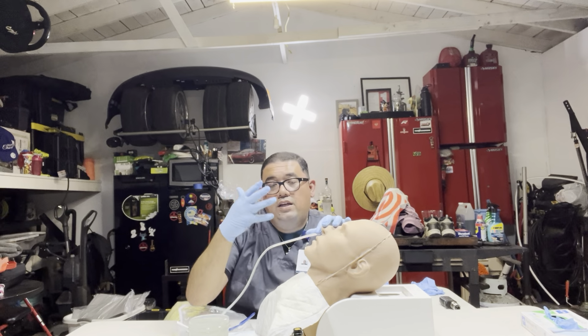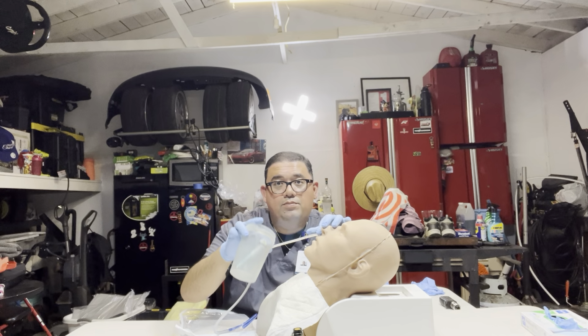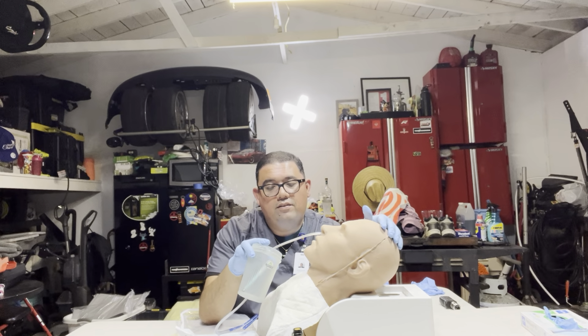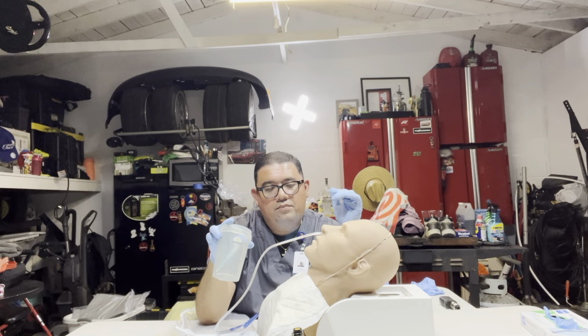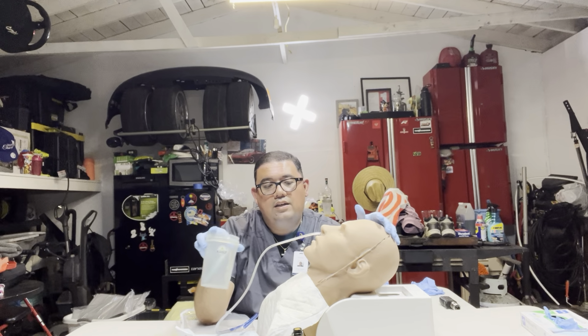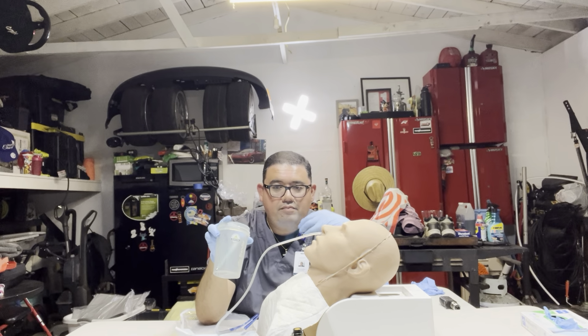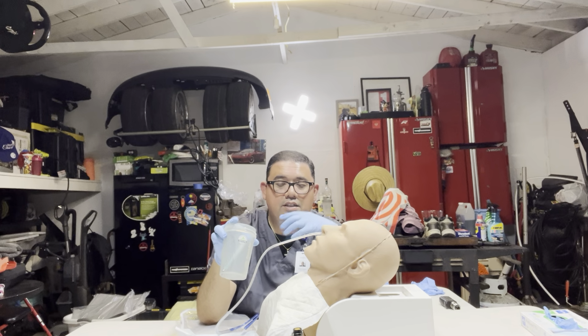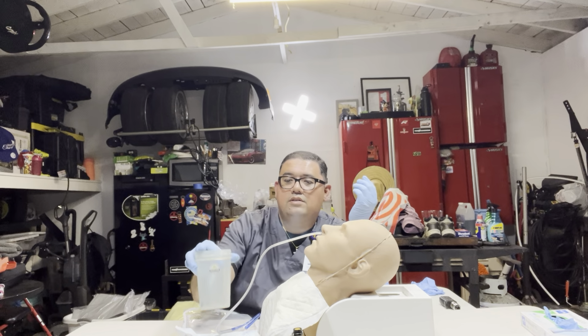So if the patient had gagged, we would stop and ask the patient to take a sip of water. We'd have him tilt his head forward, take some sips, and keep on sipping. If he had gagged or anything like that, we'll just rest and have him take sips of water to help lubricate the area so the tube can go down much easier. For this process, it was pretty successful.